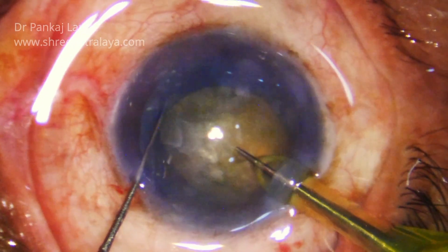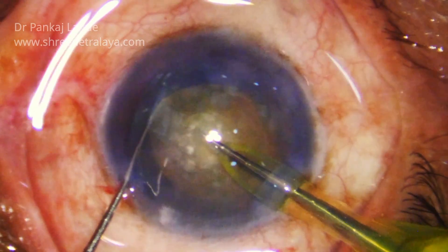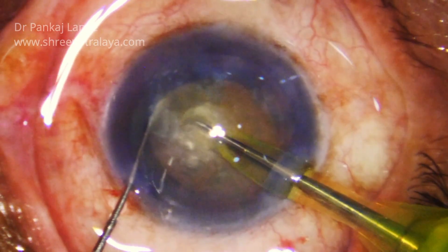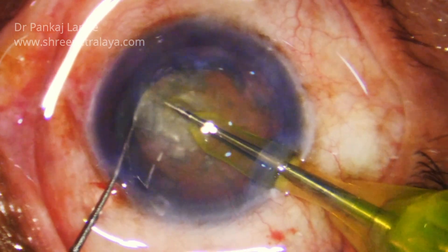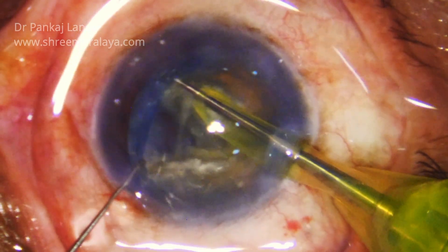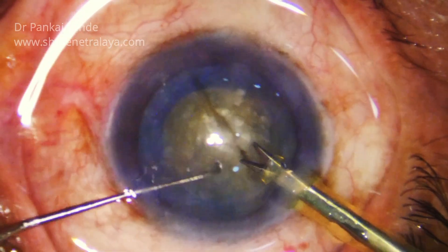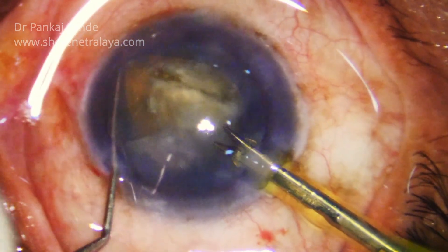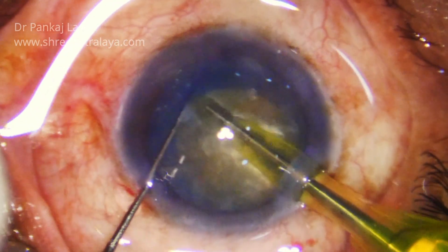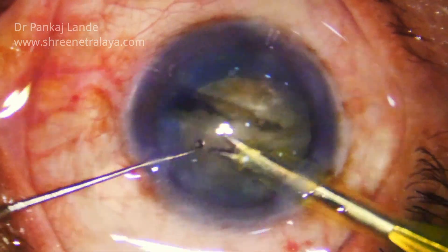Now after entering the anterior chamber and stabilising the nucleus with the left hand, I am entering with FACO power ON in the substance of the nucleus so that I will have a good grip and the ultrasonic pre-chopper moves forward and the chopping is complete. Half of the nucleus is already divided. I would like to complete this by rotating it 180 degrees and completing the first chop here.